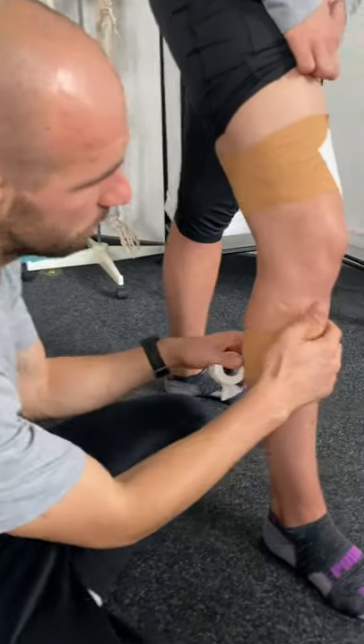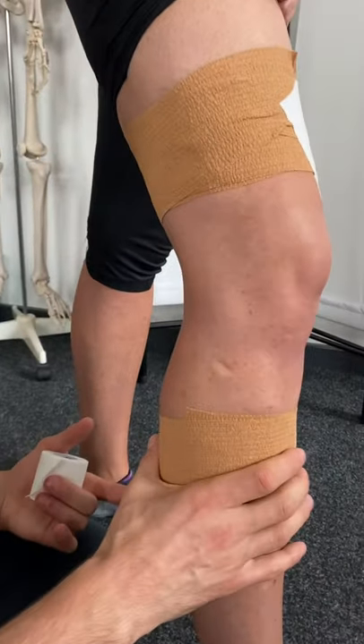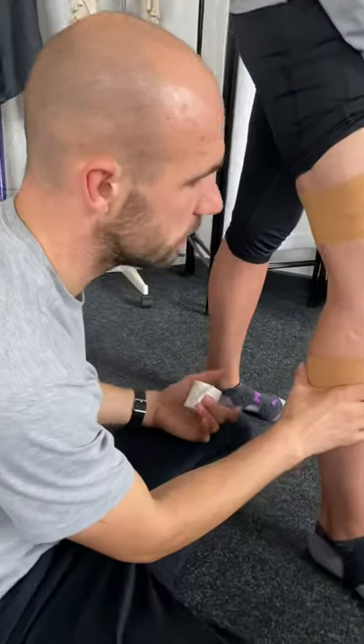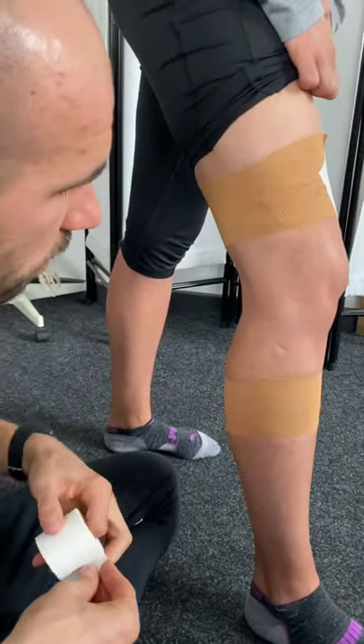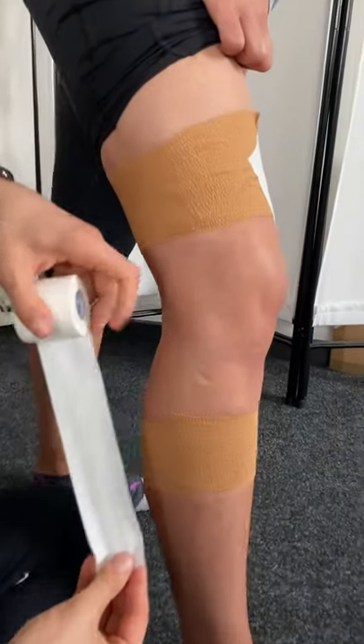So LCL — anchor just below the knee on the calf, anchor here again. Use EAB for both of these, just so that you've got a bit more give in the tape rather than a zinc oxide style.